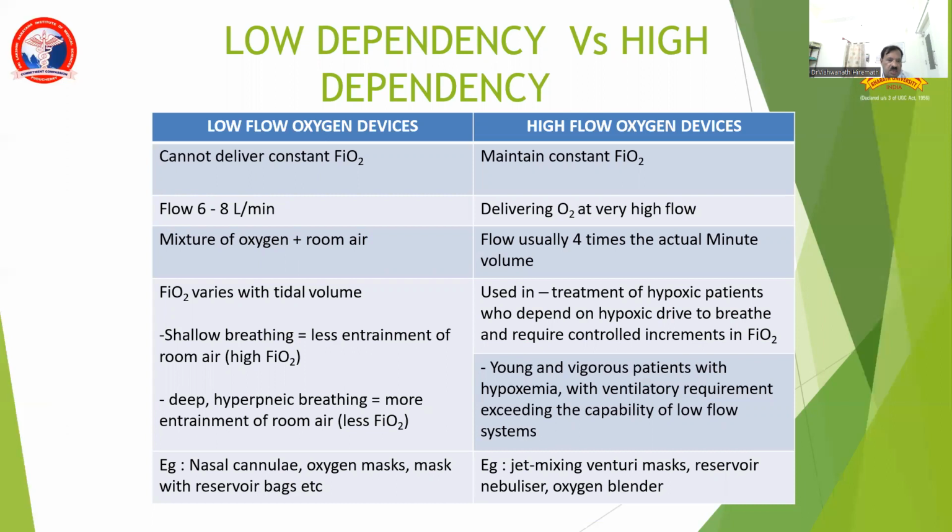In low flow devices, FiO2 varies with the tidal volume. In high flow devices, the patient will depend on the hypoxic drive to breathe and require controlled increments in the FiO2.